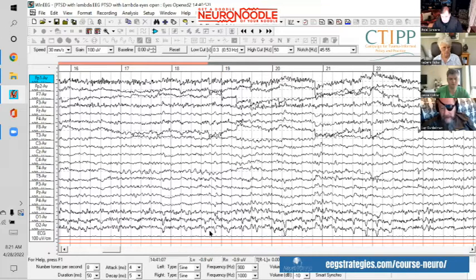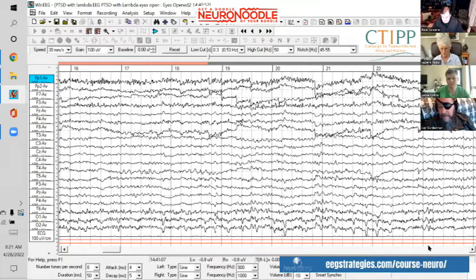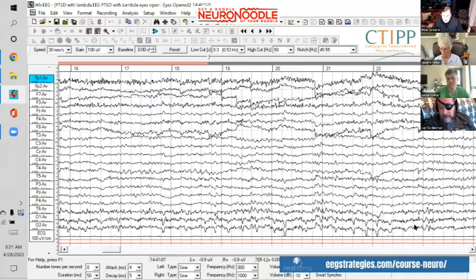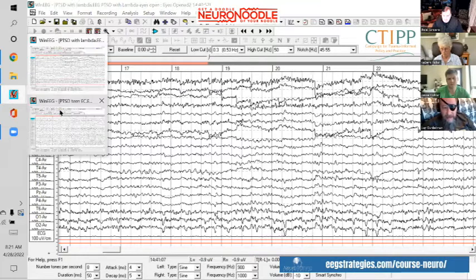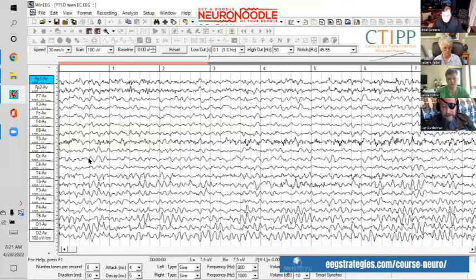There's no question about it — they're hypervigilant. Instead of making a resting state rhythmic background alpha, their alpha is attenuated, and they're making lambda waves at the back of the head. This pattern, if I see this, without knowing anything about the patient, I can tell you that they've been traumatized.